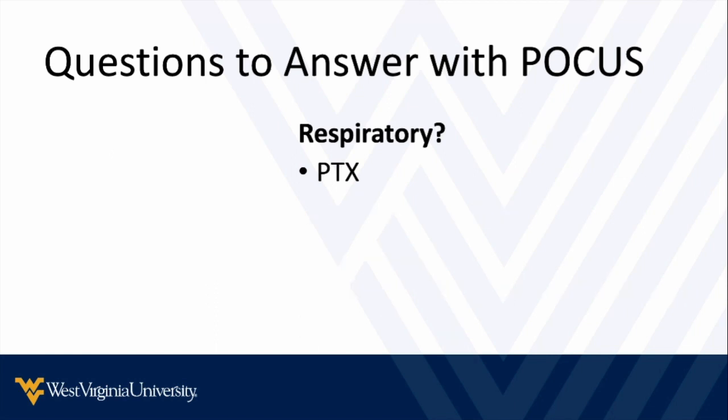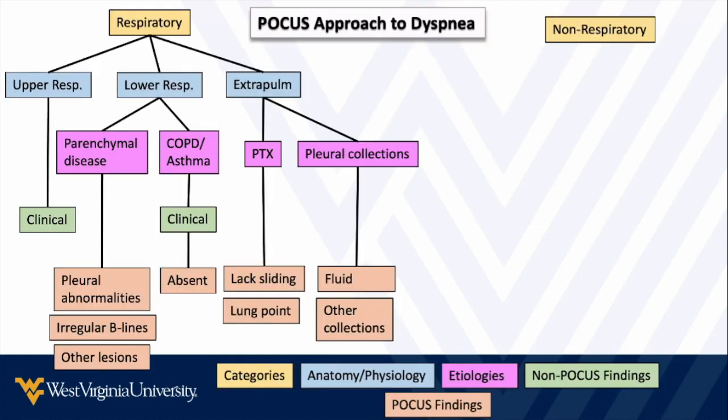So first one, is there a pneumothorax or not? Now, this is probably not as common in most emergency departments or inpatients where there's not trauma, but these do happen spontaneously, especially in patients who have been on the ventilator with high pressure settings, or they've got blebs or long-standing COPD. So definitely something that we have to think about sometimes.